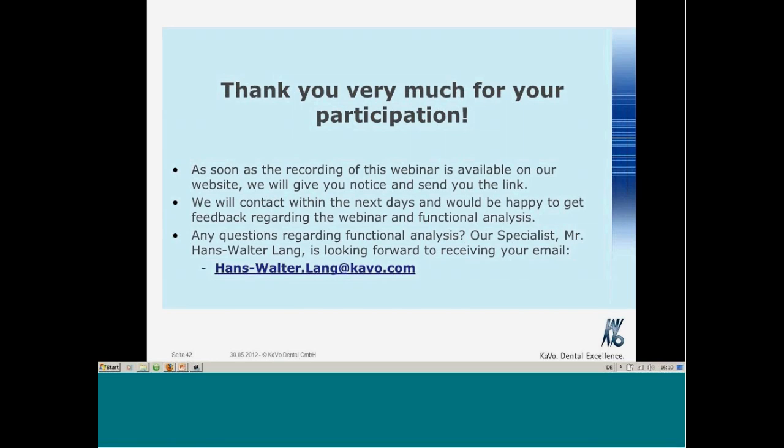Of course, you can do it, but you don't need it because you can transfer the position with a KaVo transfer system, with a mounting stand, and with the calculated values. There is no longer need for this kind of face bow transfer, but if you want. And if you don't use the Protar articulator system, you have to do it.